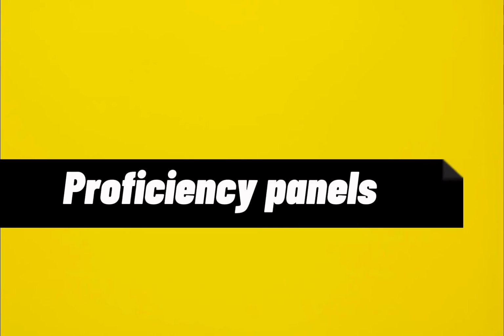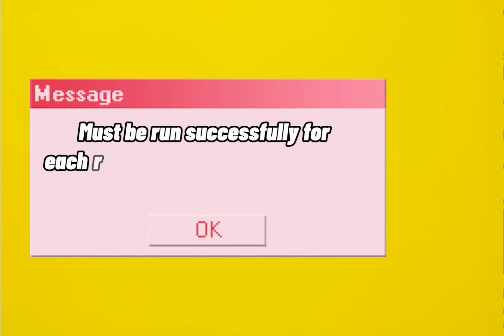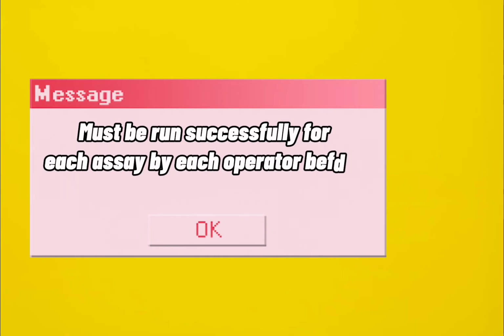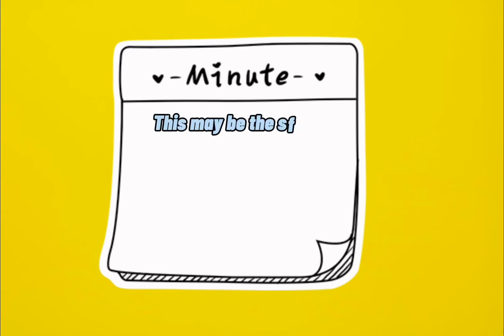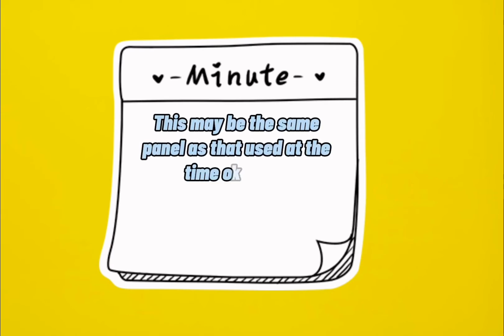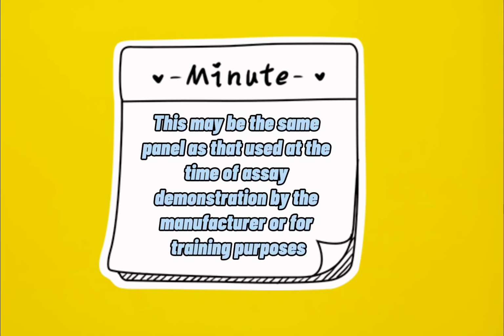Last but not least, proficiency panels. A proficiency panel must be run successfully for each assay by each operator before the evaluation commences. This may be the same panel as that used at the time of assay demonstration by the manufacturer or for training purposes.